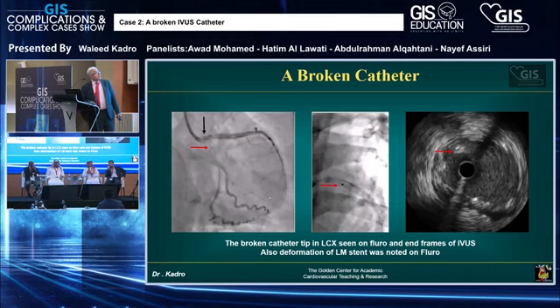So this is a fixed picture just explaining everything. Just before we go any further, this is Boston Scientific, I'm assuming, right? The IVUS catheter type is Boston Scientific, that's correct. And you faced the resistance on the way in or on the way out? No, just on the way out, from the circumflex. You realized this later on after you built everything? Yes. So you have a wire in place now, still?